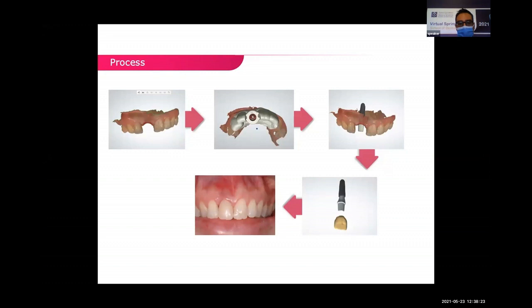In the library of the software, we have different brands of implants and different dimensions and lengths of implants. We can choose our patient's brand of implant from the library and virtually do an operation on the patient's images and place the implant in the proper position.